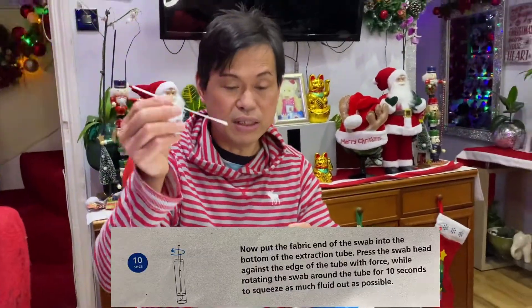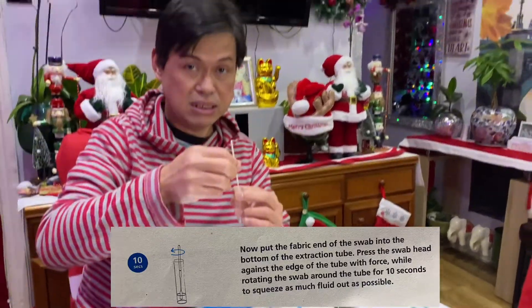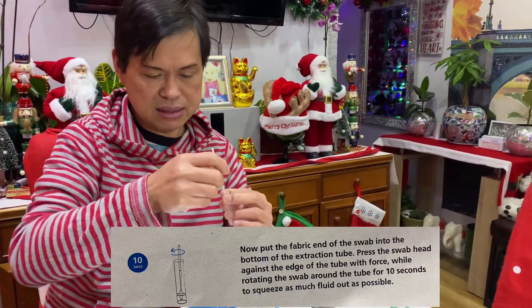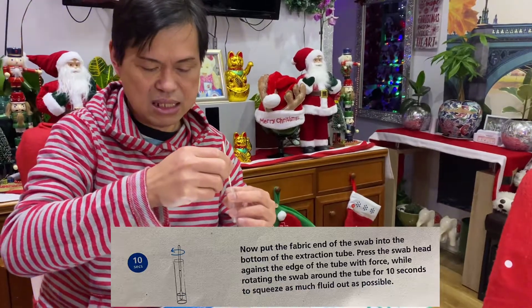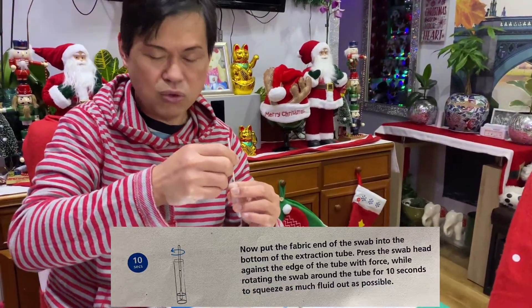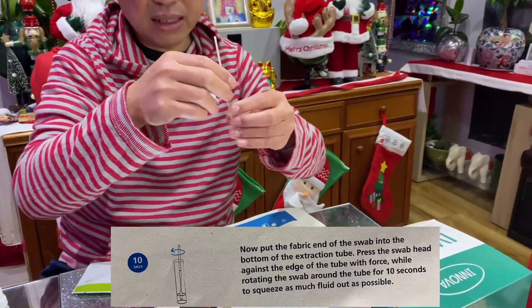After that, insert the swab into the extraction tube and twist it for about ten seconds, squeezing and twisting so that all the fluids go into the tube.